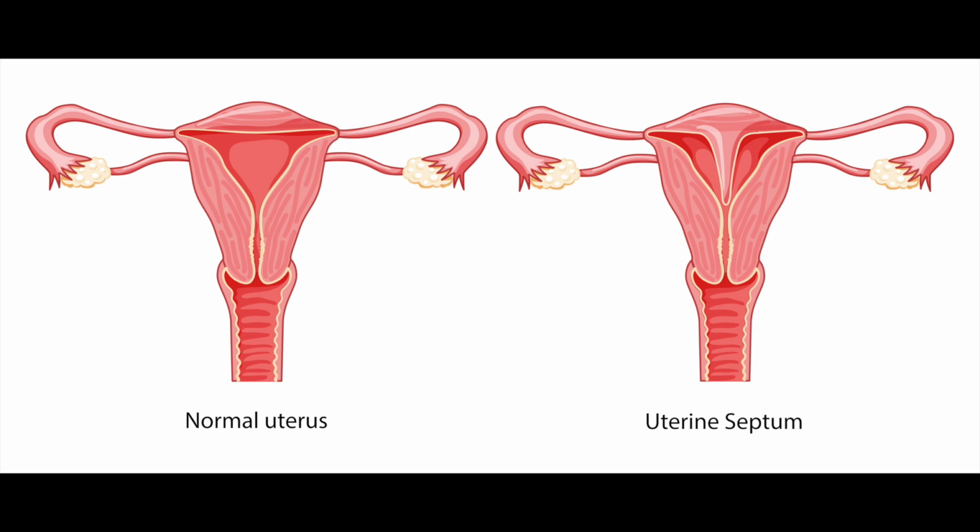The definition and management of a septate uterus remains a controversial topic. Recent data from an international multi-centered cohort study are inconclusive, observing the success of this procedure regarding fertility.